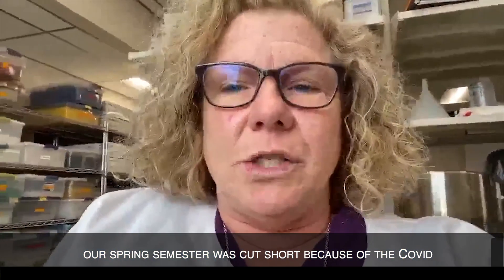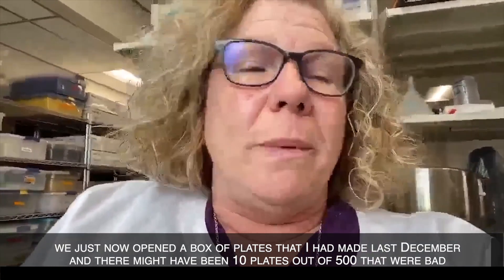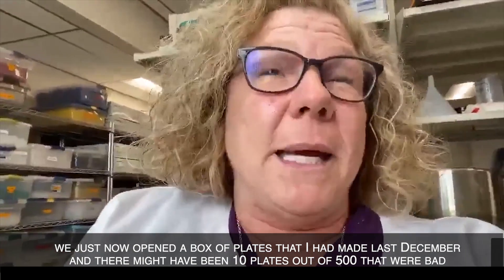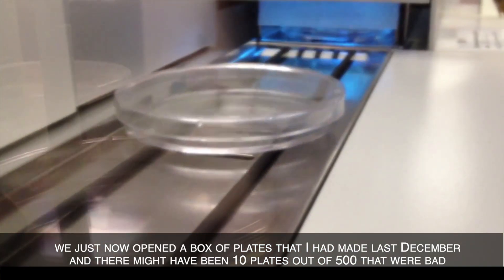Our spring semester was cut short because of COVID. We just now opened a box of plates that I had made last December, and there might have been 10 plates out of 500 that were bad.